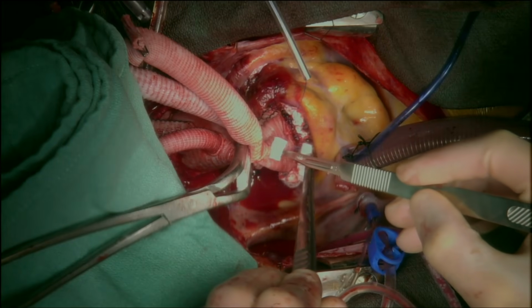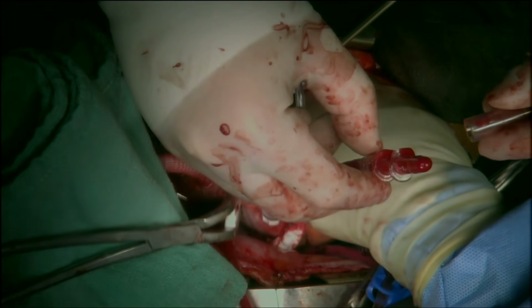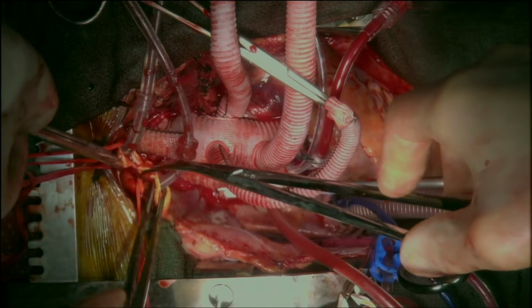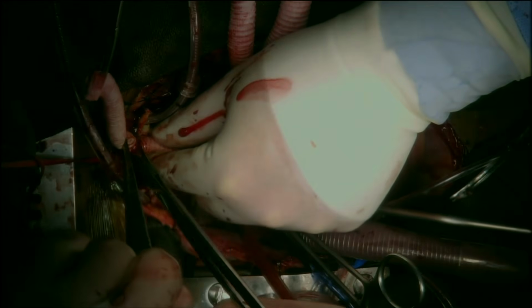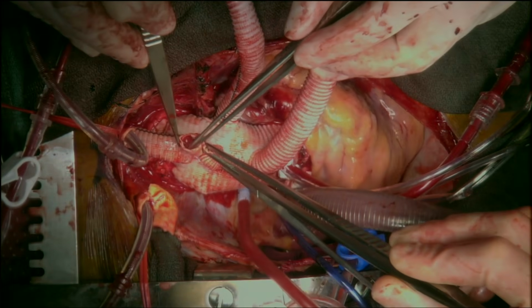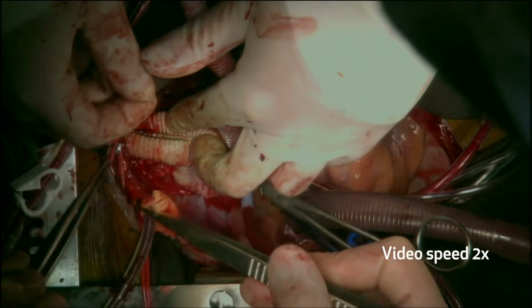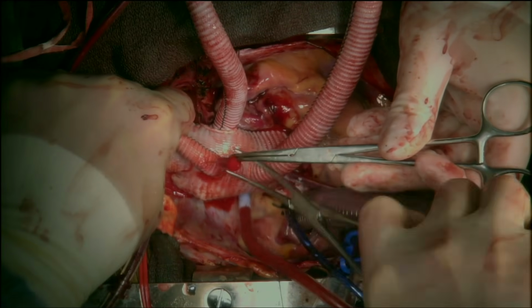The heart and the aorta were de-aired through an aortic root vent, and the cross clamp was released. Next, the common carotid and the innominate arteries were separated. The 8 millimeter branch of the graft was clamped and trimmed. This was anastomosed to the left common carotid artery with a running 6-0 Prolene suture. The anastomosis was de-aired as the clamps were released.